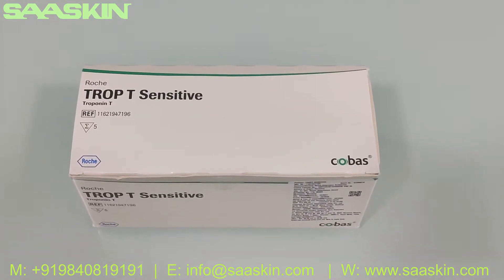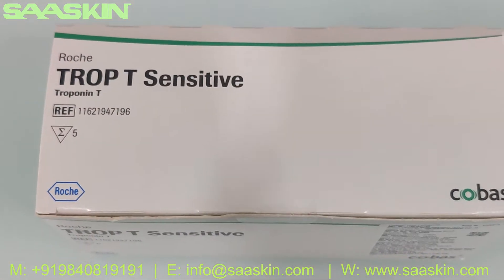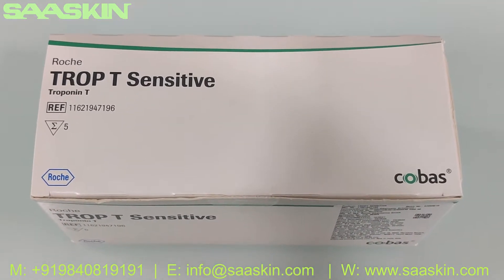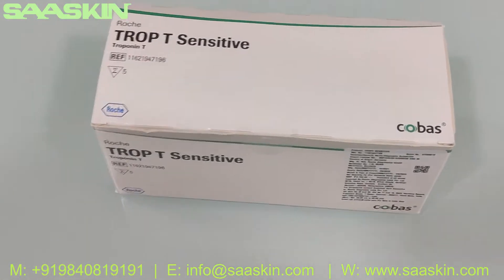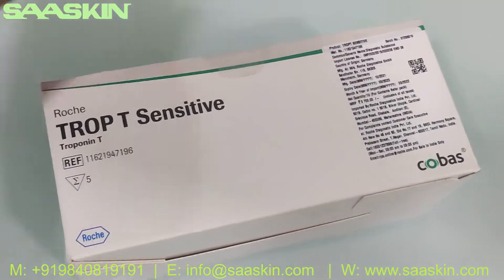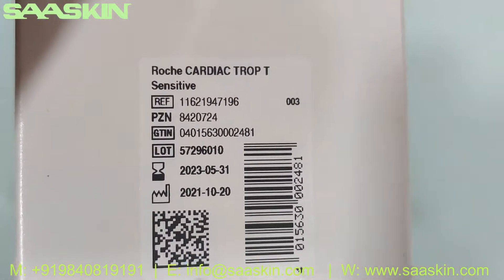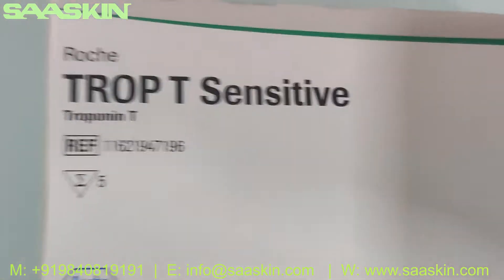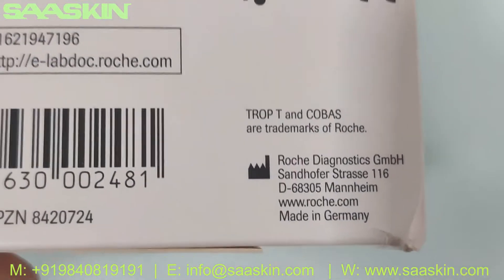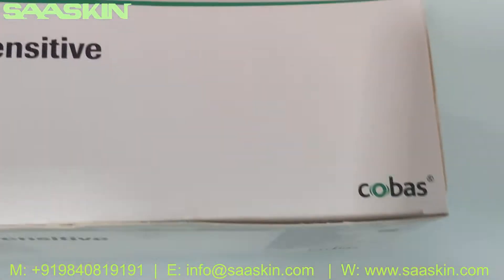Hello everybody, today we're going to see the unboxing of the Roche drop T sensitive test kit. It's basically a visual test for the rapid diagnosis of myocardial infarction — a cardiac marker test. The box has a standard two-year validity. It's a complete CIBD certified product, made in Germany.